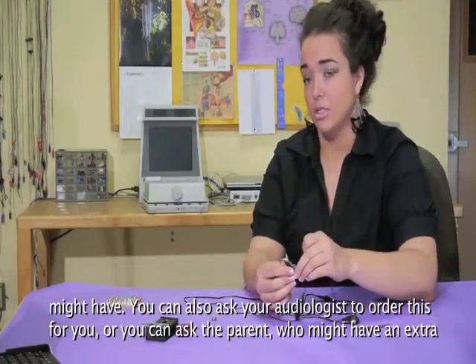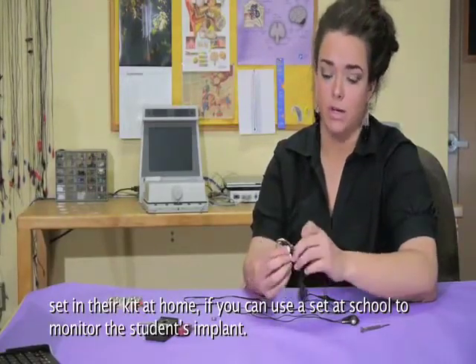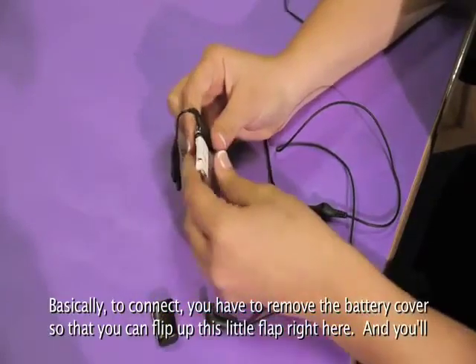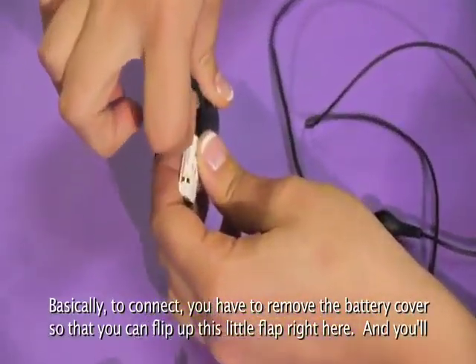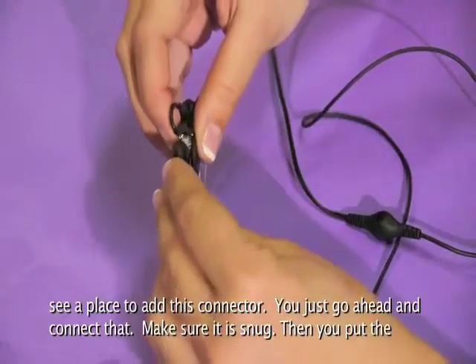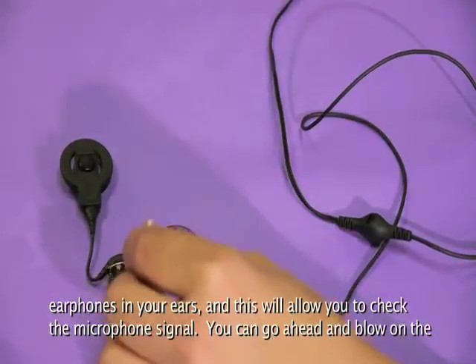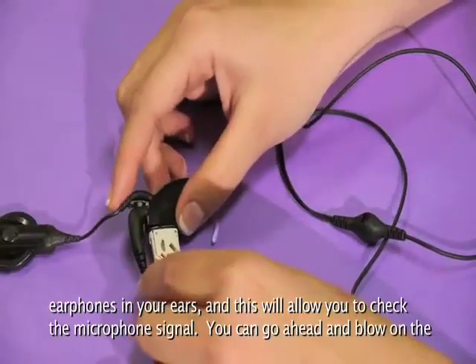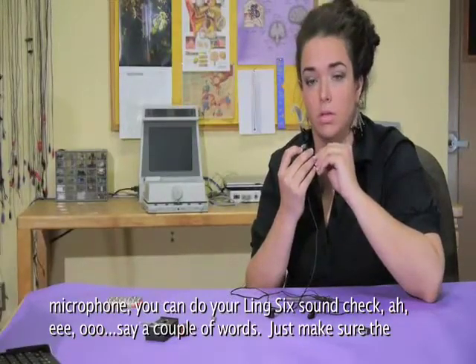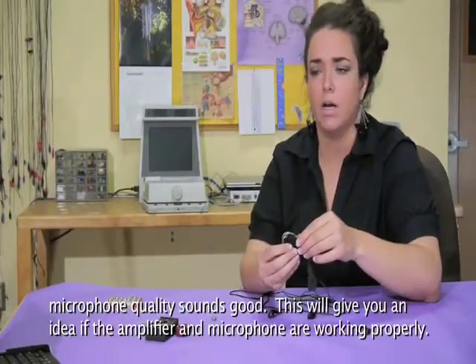You can also ask your audiologist to order monitor earphones for you, or ask the parent who might have an extra set in their kit at home. To connect, you have to remove the battery cover so that you can flip up the little flap and connect the earphone connector — make sure it's snug. Then put the earphones in your ears. This will allow you to check the microphone signal. You can blow on the microphone or do your Ling 6 sound check — ah, ee, oo — and say a couple of words to make sure the microphone quality sounds good.